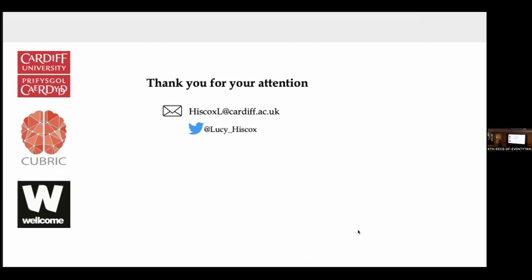Okay, so I was thinking if you have a task, for instance, to see how the MRE changed compared to before the task, at rest, after a memory task or a sport task. There has been a study on that. It's in review at the minute, where we did an acute exercise. It was only about 20 people, but they either rested or did a lot of star jumps and things like that. And there was an acute change in tissue stiffness that then correlated with a change in memory as well. Right.